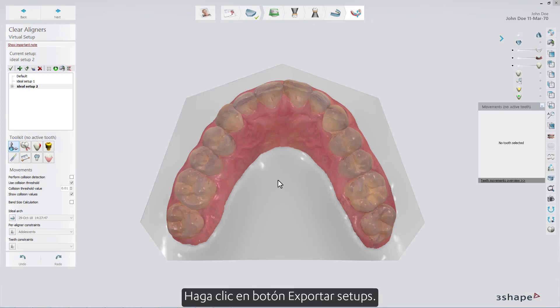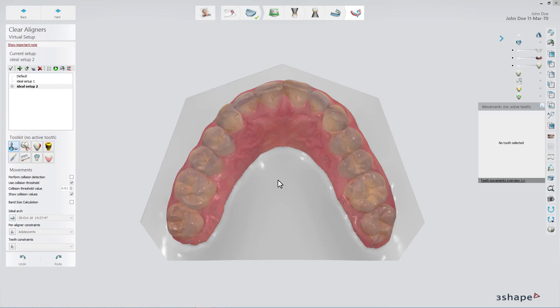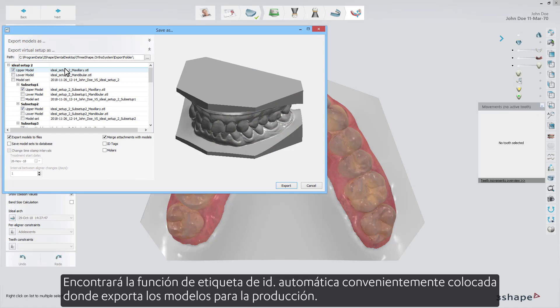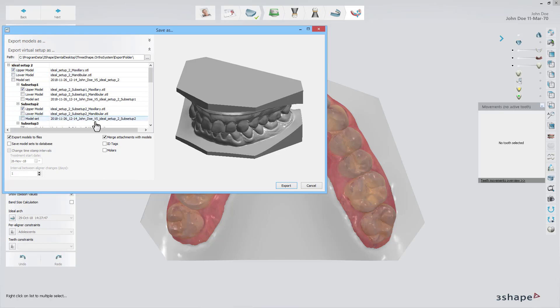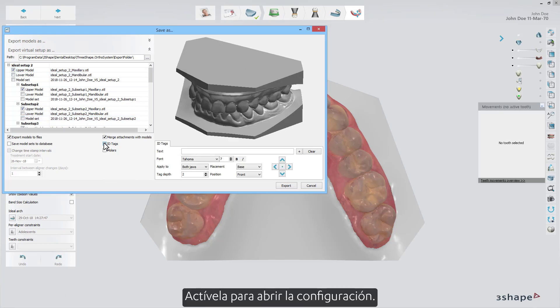Click the Export Setups button. You will find the automatic ID tag function conveniently placed where you export the models for production. Enable it to open the settings.